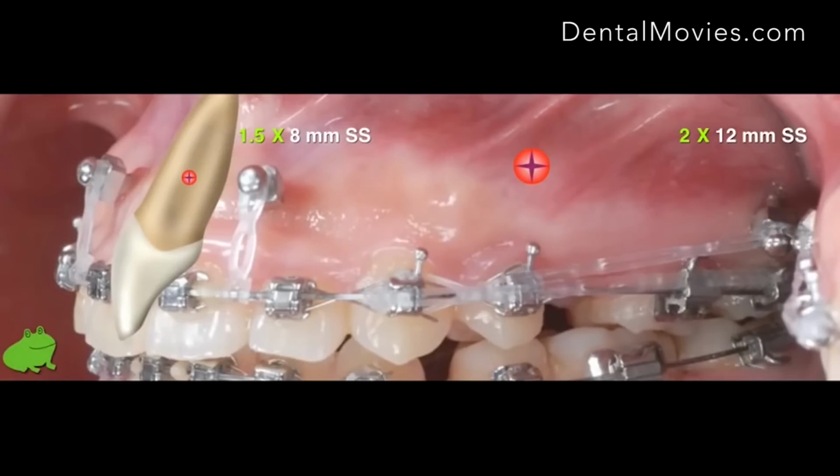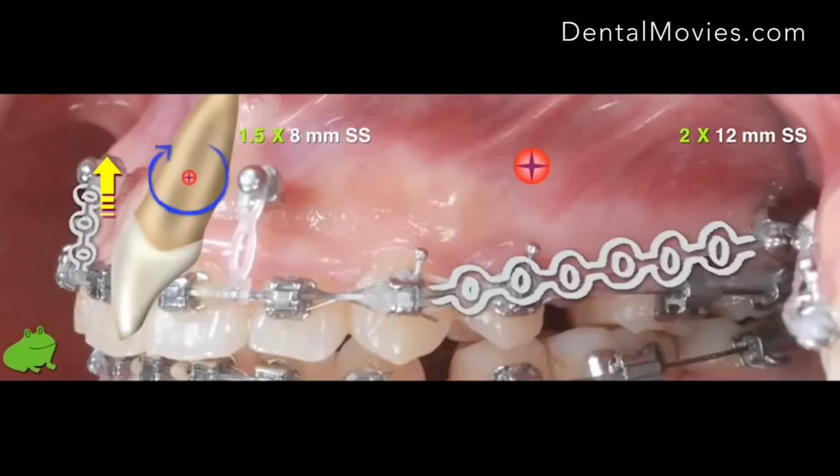First, when you have a power chain, the center of resistance is here for the incisors. So you pretty much will get an intrusion and you will flare the upper incisors out. So you create a moment, so you flare the upper. And you also have a retraction force. With this retraction force, you have a retraction vector, and also you create a moment.